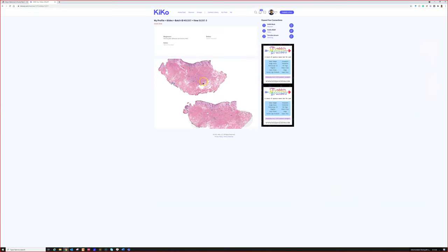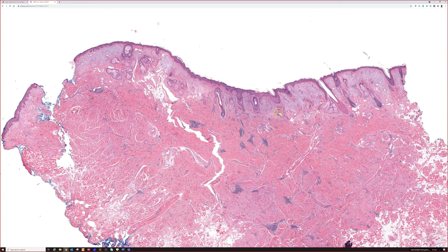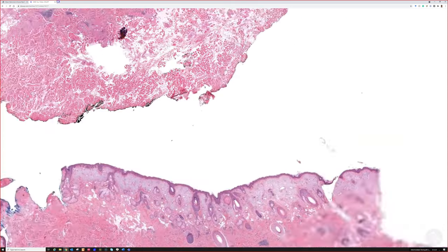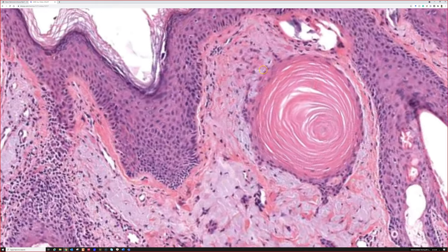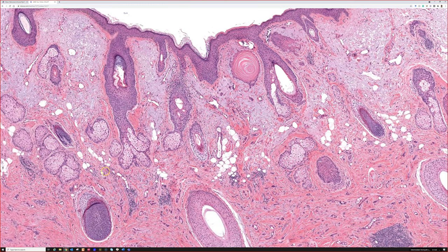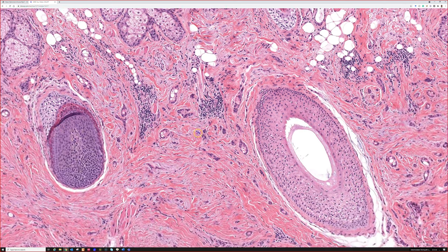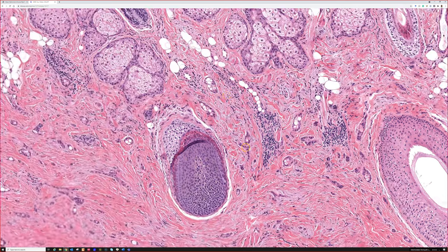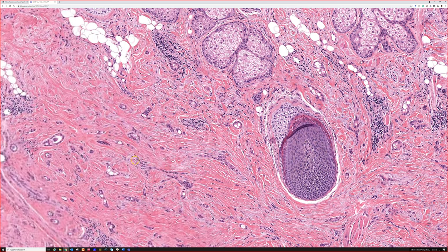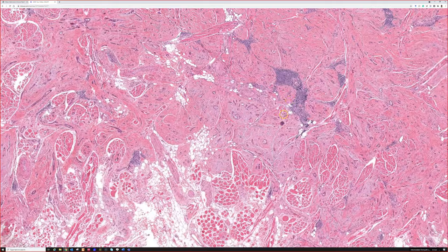I did pull up another example to show you here. This is probably the best one I've ever seen. And this one's good because, I'll put a link for this in the video description if you're watching this online. See there, keratin filled cyst, little microcyst filled with keratin. And then little ducts and tubules down here that are infiltrating. See, they're everywhere. These ones have multiple little duct lumens. And they're infiltrating way down deep, way into the skeletal muscle.